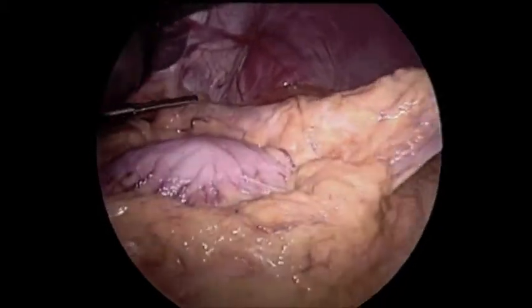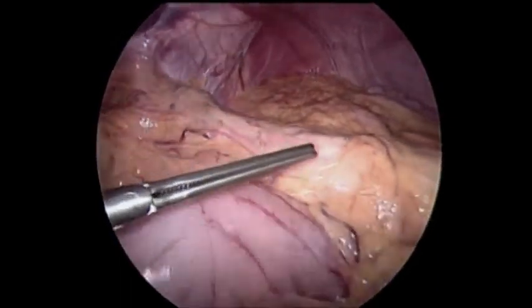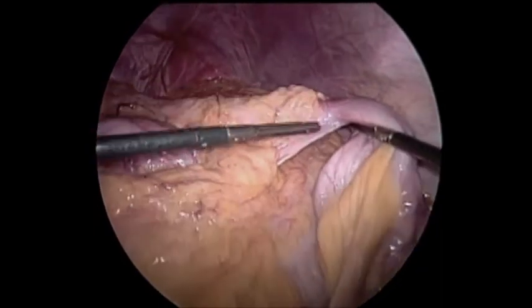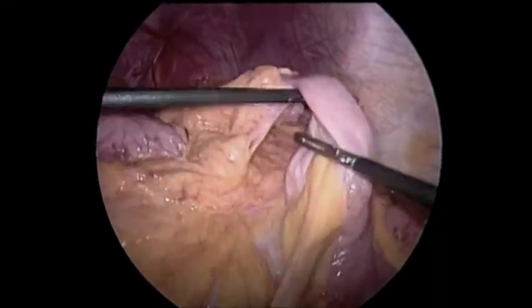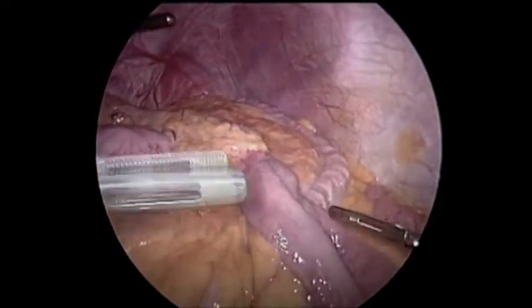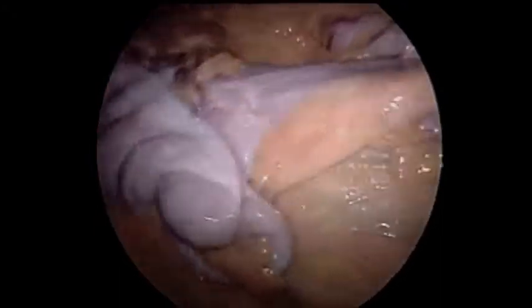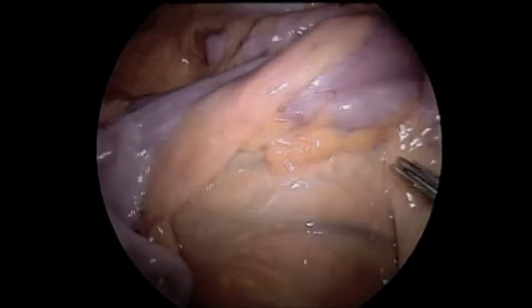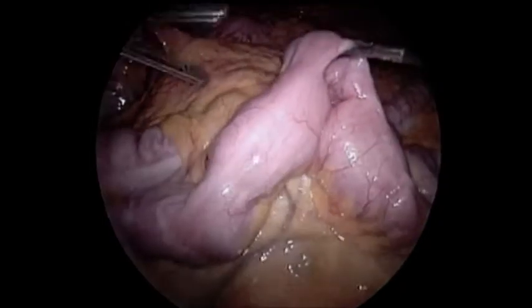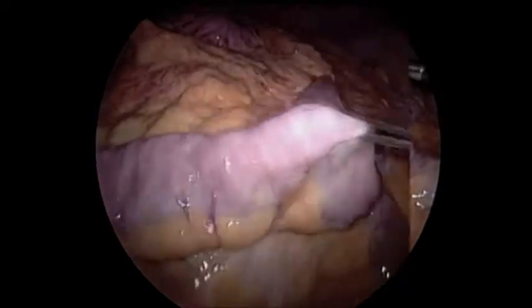When we first looked laparoscopically, we were happy that there were not too many adhesions present. You can see there is a very long gastric pouch — we later measured it to be about 15 centimeters in length. There's the anastomosis between the stomach and the ileum, and you can see a widely patent Peterson space behind the intestine. We needed to confirm the anatomy, so we went down to the ileocecal junction and measured backwards, confirming that there was only about a 100 centimeter common channel — a highly malabsorptive operation.